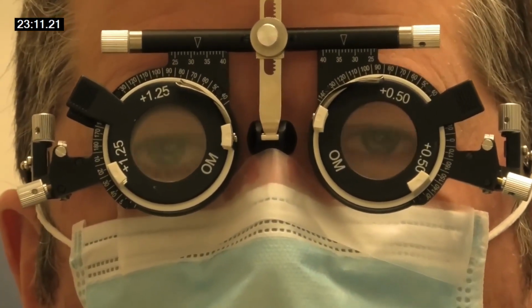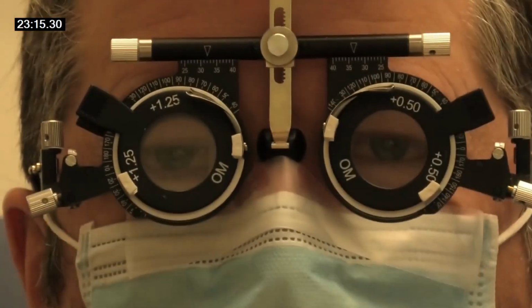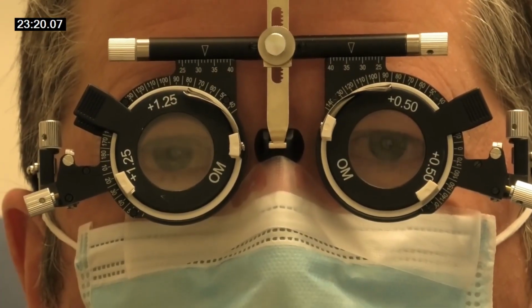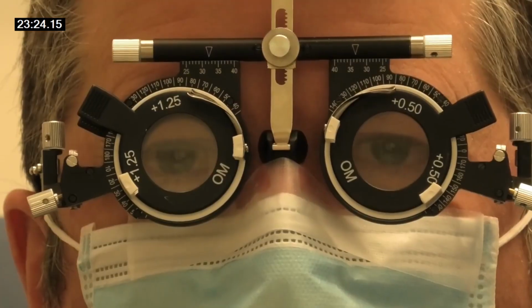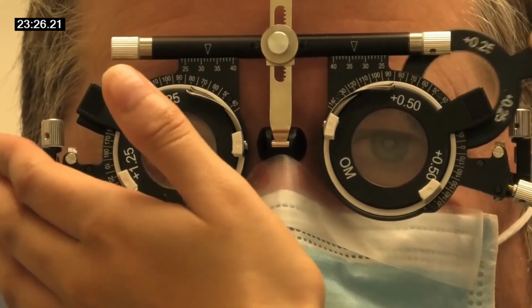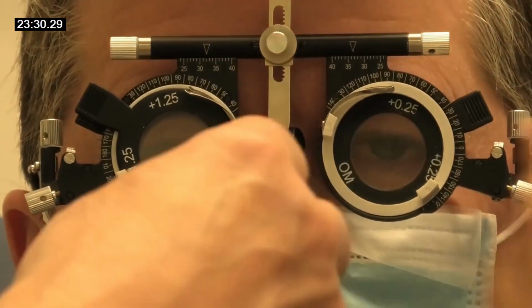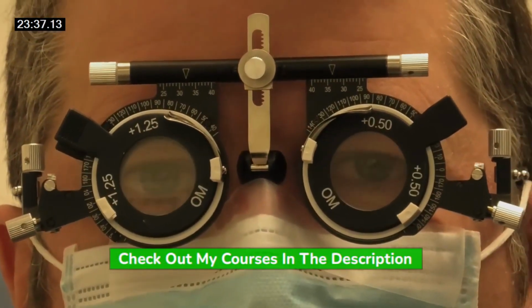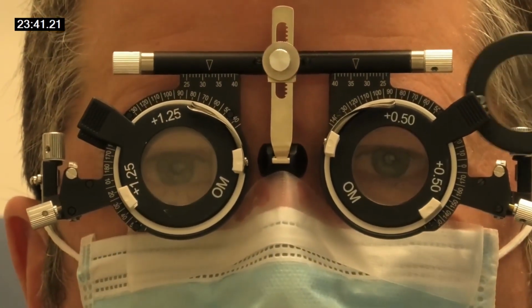What about red? Okay, so then we put the blurring one in this side and take this one out. So we can get one from there. So that's right. Yeah. So what we're trying to do is keep it blurred all the time, to relax his accommodation because he's got a bit. So the blur. That's why I put the blurring lens in.